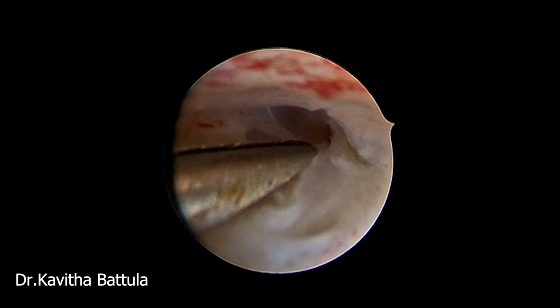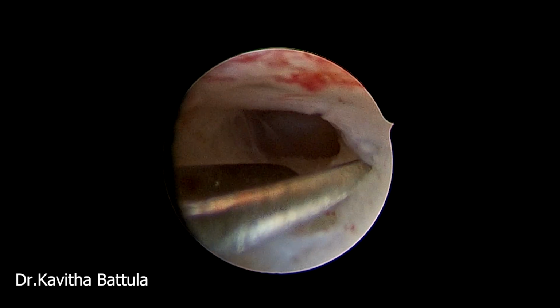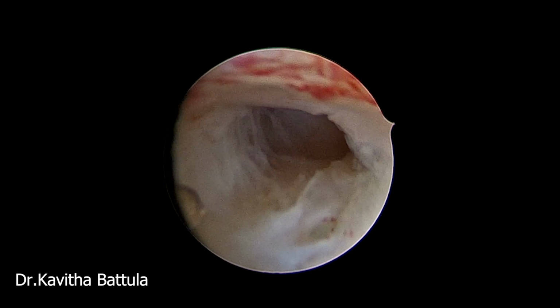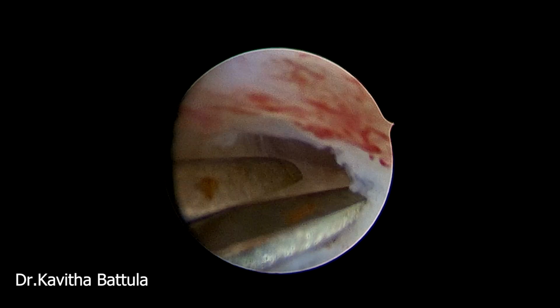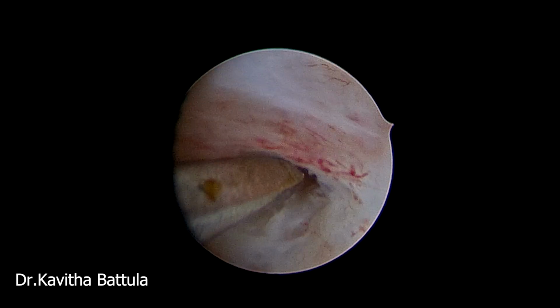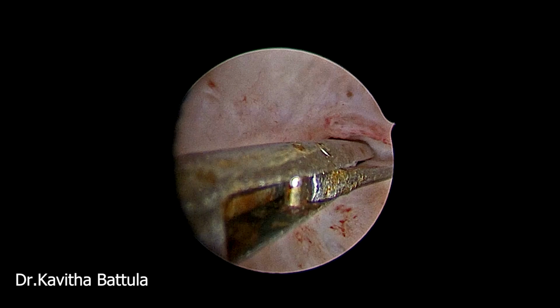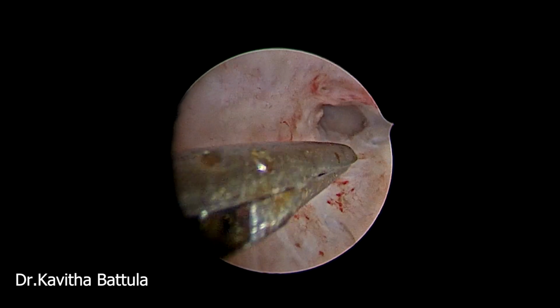Also, there may be a deflected uterus from the endocervical canal. So we are trying to enter the uterine cavity by incising the internal os as seen here. Still we have not entered into the uterine cavity. We are trying to cut on either side. So going bit by bit with incision, but we are not able to see the cavity.